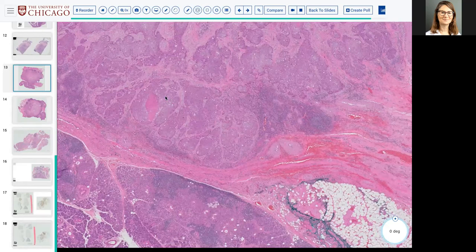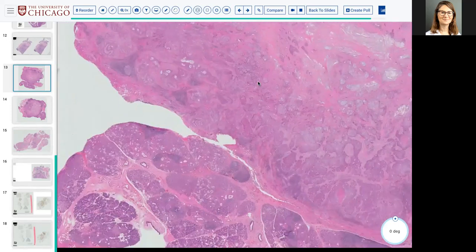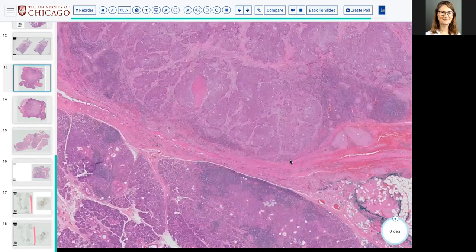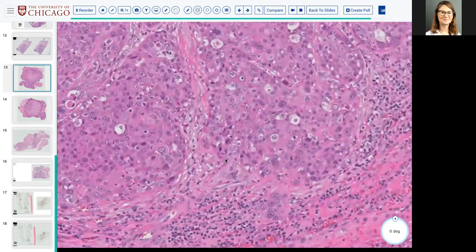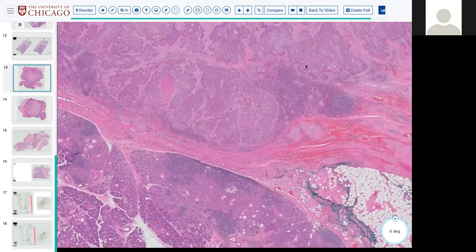So would you consider intraductal carcinoma? Do you mean intraductal or salivary duct? Because intraductal carcinoma is a low-grade tumor that is bounded, where these nests are bounded by a P40 positive, P63 positive, SMA positive myoepithelial cell layer, and really are not invasive.